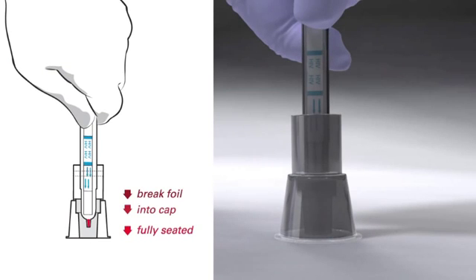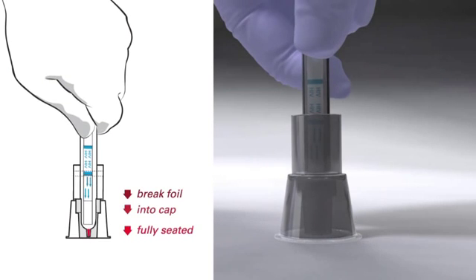One: through the foil. Two: into the cap. And three: seat and seal.